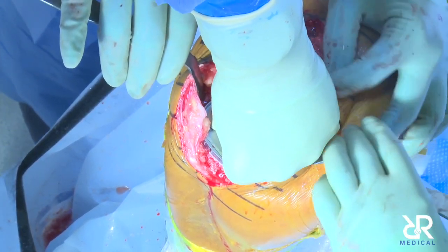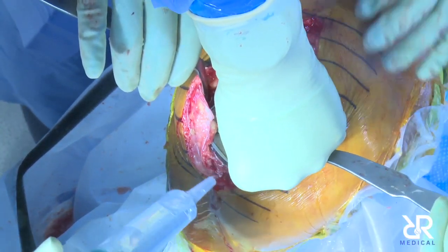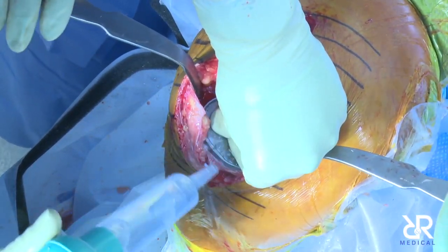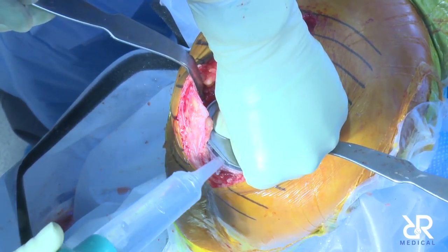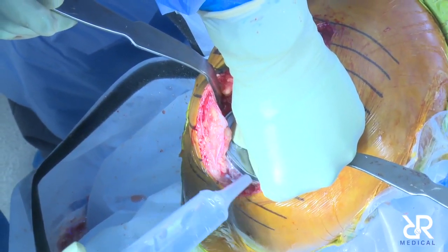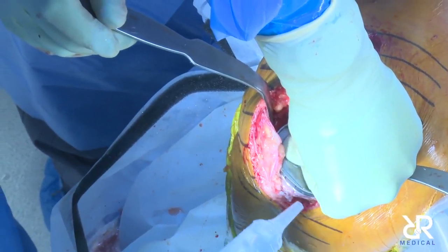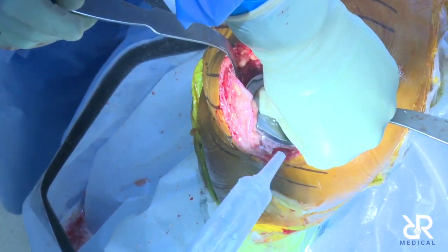Warm water? Yeah. I just don't think the Mako is accurate. I mean, you know, Valentina and I have had this conversation multiple times. And when you measure those posterior cuts, sometimes they're accurate, sometimes they're not. But the stacking of errors is there. So.